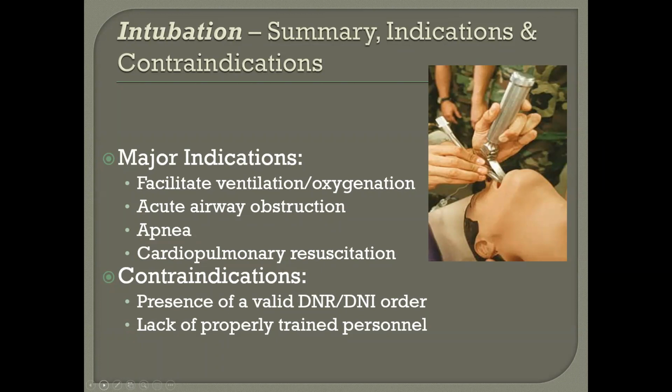Part of it was familiarity with some of the GlideScope system that we recently got. We use video scopes, McGrath video scopes, so we're pretty familiar with those, but we reviewed some of that as well. And then the old-fashioned, the good old intubation boxes, with what you're seeing in this picture here. It looks like that laryngoscope is probably stainless steel, and it's pretty much the traditional method that's available in most intubation boxes.